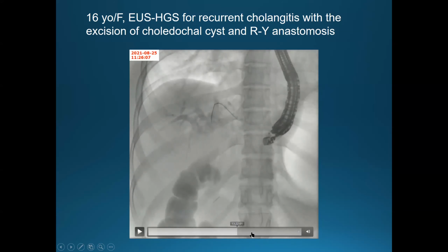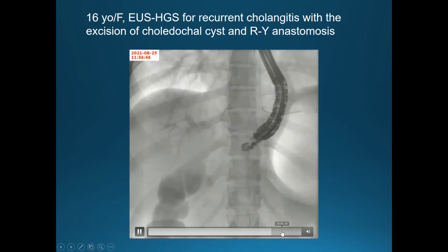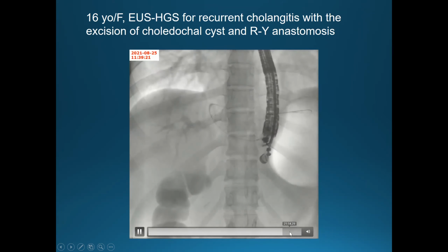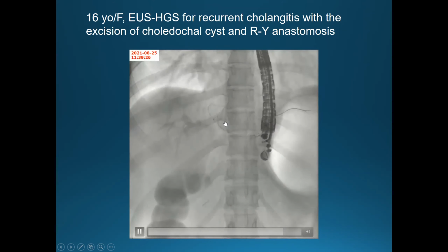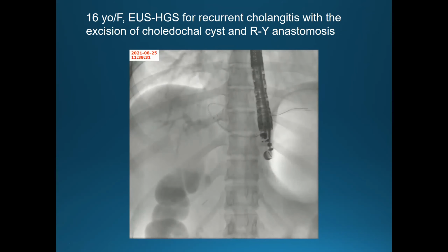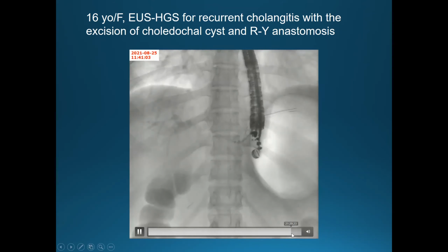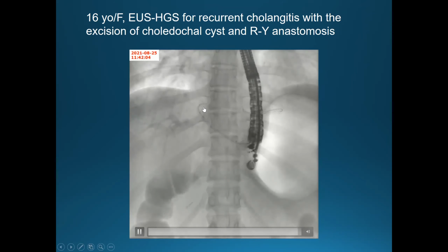Here, at this time we change the guide wire so that it goes towards the peripheral duct. Then the stent is deployed like this one. It's easier than the central approach or going towards the hilum. But there is some risk of bile leak, so at the time I use a nasobiliary drain tube inside the stent, which is very useful for the prevention of cholangitis or bile leak like this one.